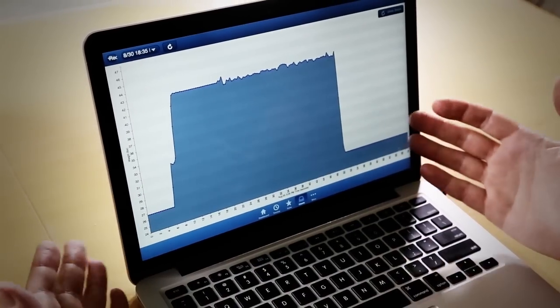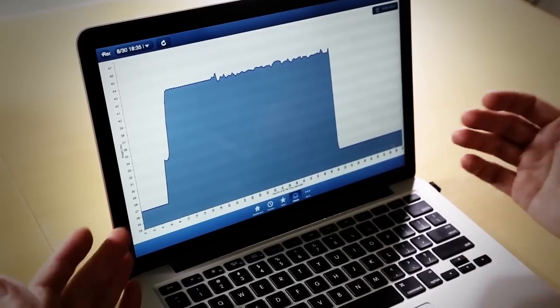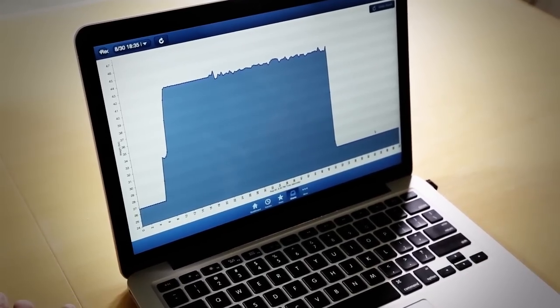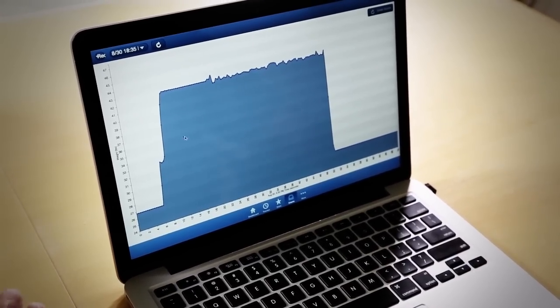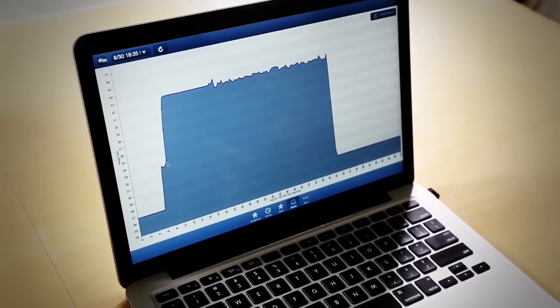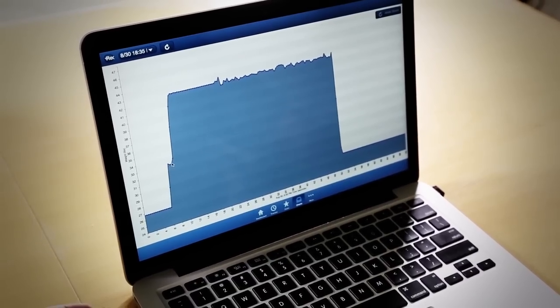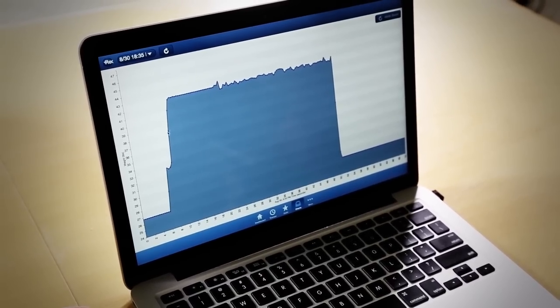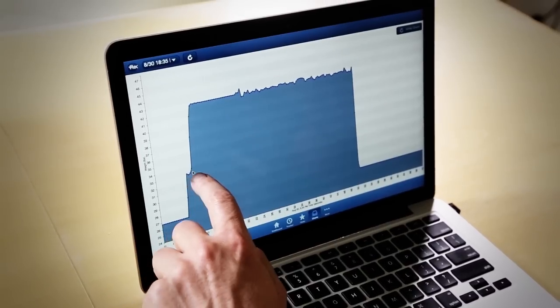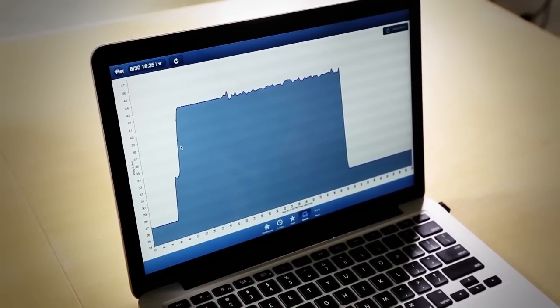So here in front of us is actual data of the cat's visit to the box. The interesting part here is that you can see if the cat stepped in the box or jumped in the box. In this case, she stepped. You can see that the weight went up a little bit.